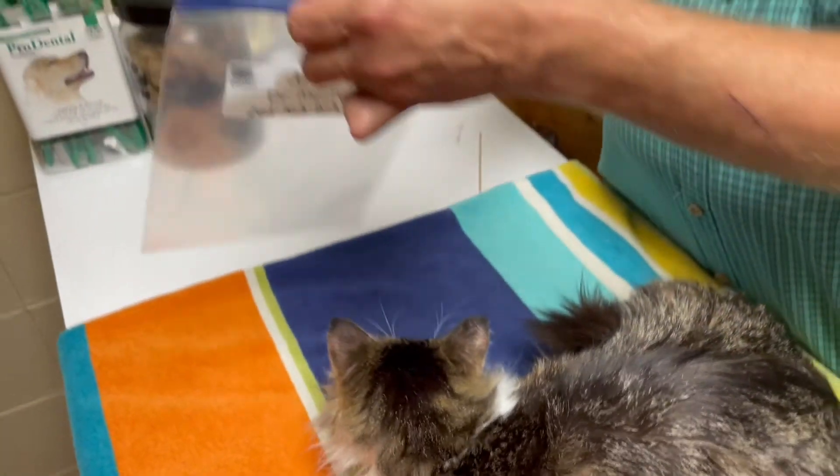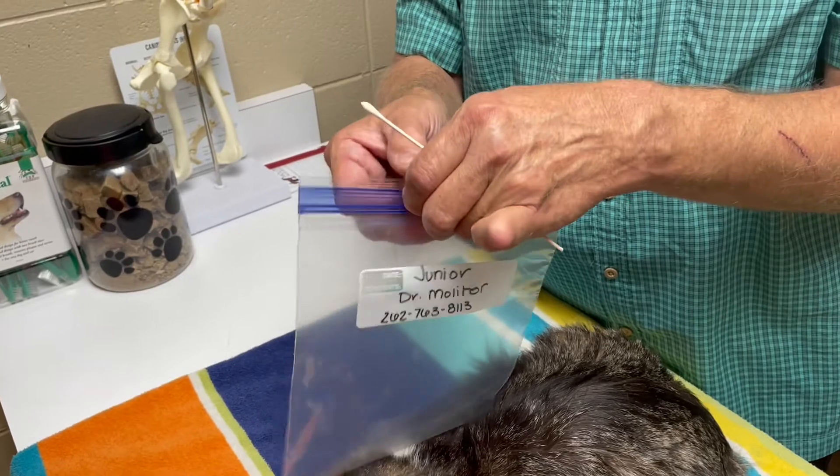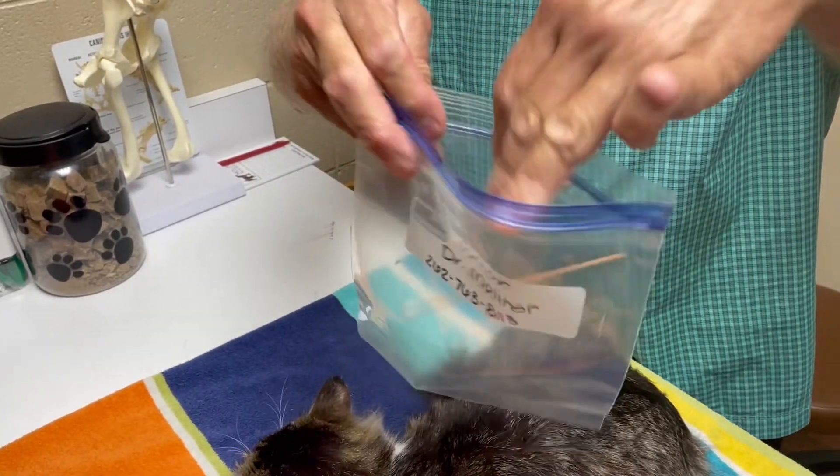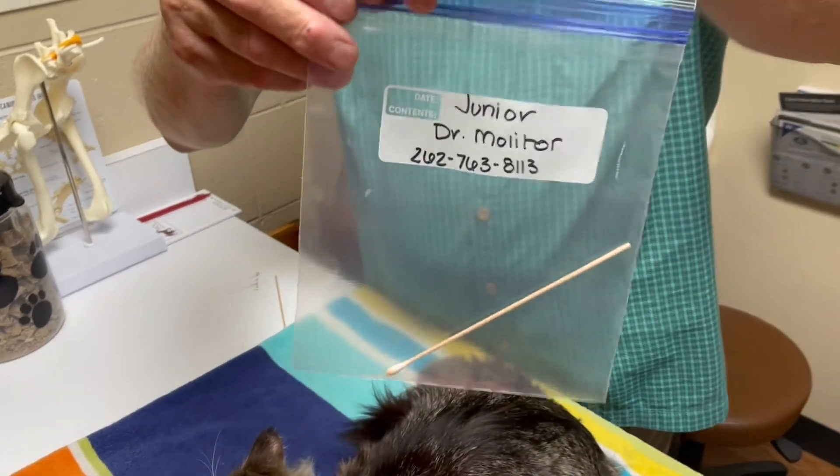Once you've collected your sample, go ahead and put it in the plastic bag labeled with your pet's name, your first and last name, and the best phone number to reach you at. We should only need one q-tip to test.